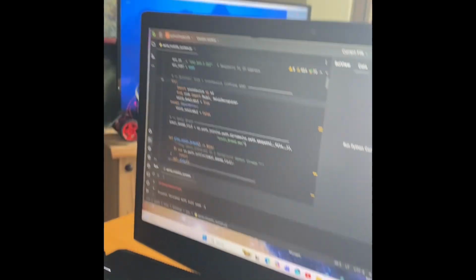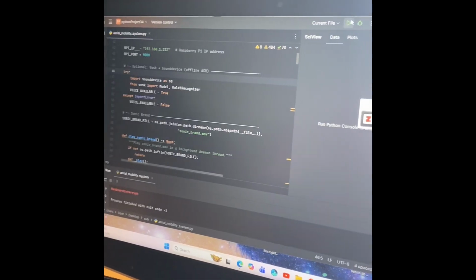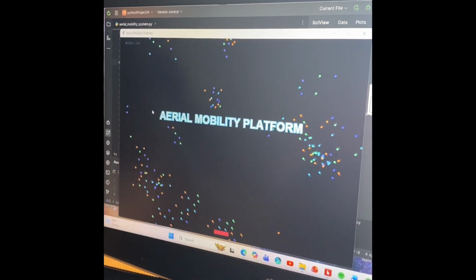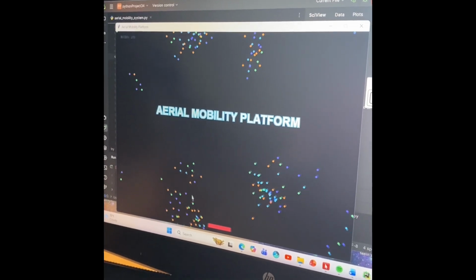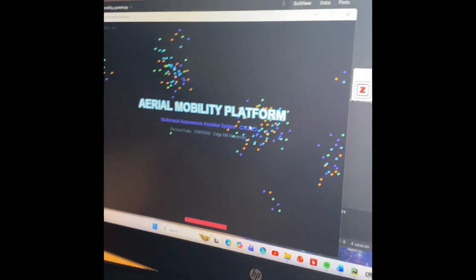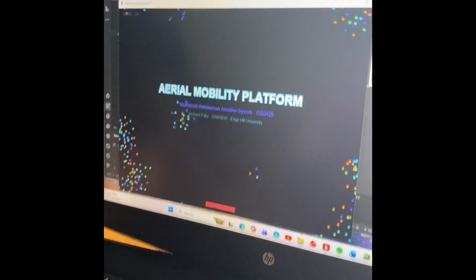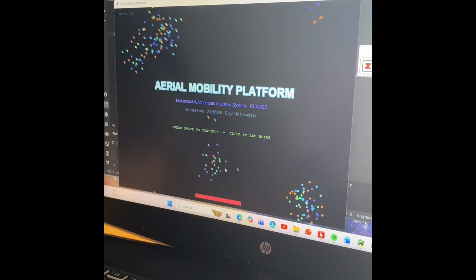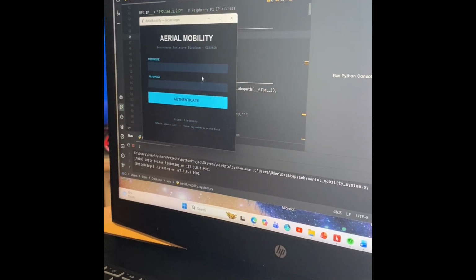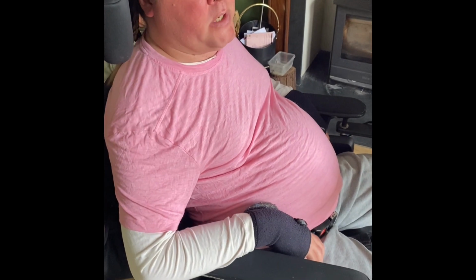So now you run the aerial mobility system Python file on the other computer, and it will run the graphical user interface branding screen to start with. Aerial mobility platform, then you've got a loading bar here, and multimodal autonomous assistive system, Richard Fowler, Edge Hill University, and then the system should allow you to either press space to continue or simply move through to the login screen. So this interface is the part that is truly multimodal.